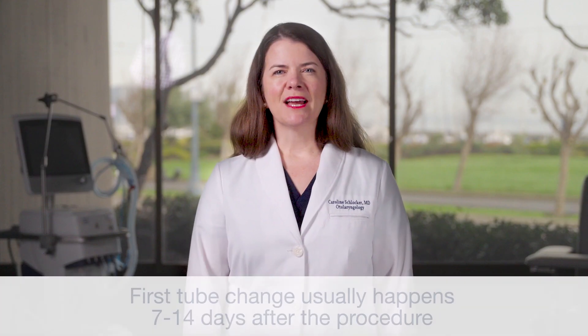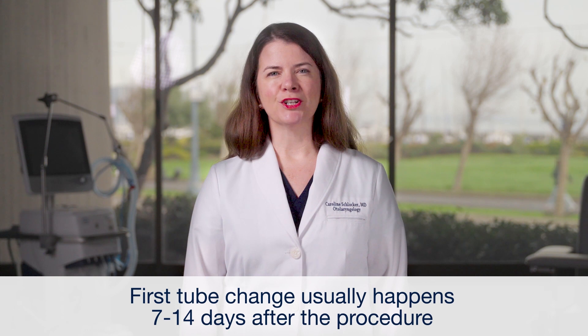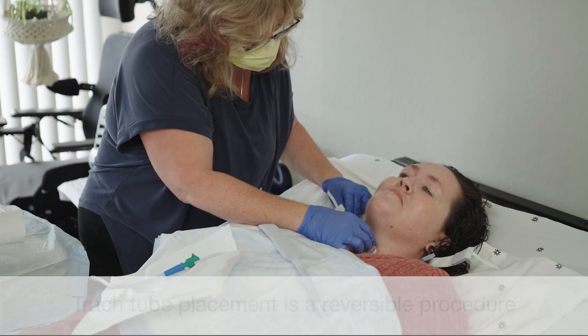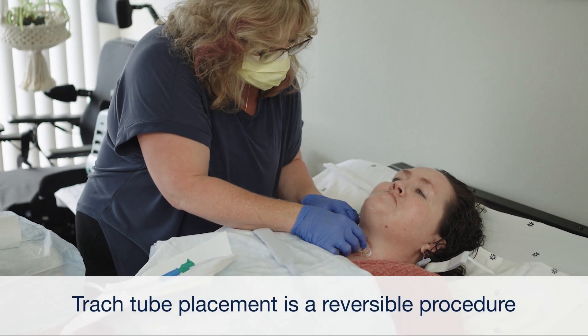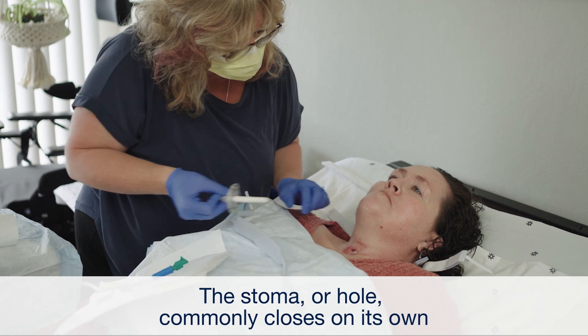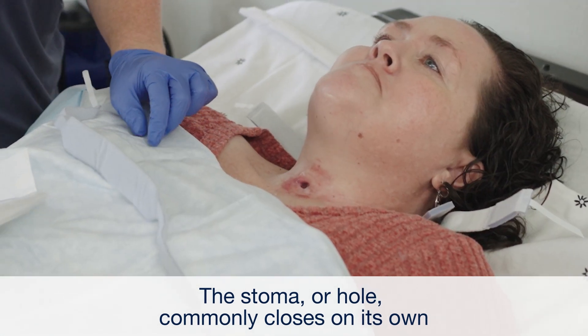The first tracheostomy tube change usually happens between seven to 14 days after the procedure. Around this time, many patients can talk and even eat with the tracheostomy tube in place. Trach tube placement is a reversible procedure. When the tube is removed, the stoma, or hole, most commonly closes and heals in days to weeks on its own. Rarely, a secondary procedure is needed to close the stoma.